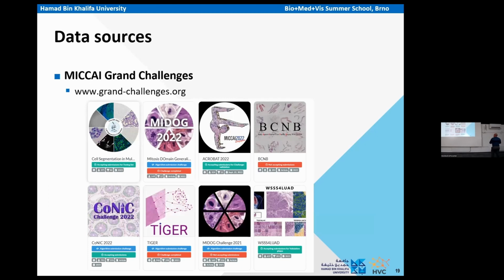And finally, for what concerns data sets, for all of you who could be interested, regularly in MICCAI and Kaggle they release challenges in which various kinds of data for different tasks related to different protocols are released, and they can be used for investigation, for developing models, and so on. So in any case, the computer vision community and the machine learning community are very active in this field, and things are improving day by day.